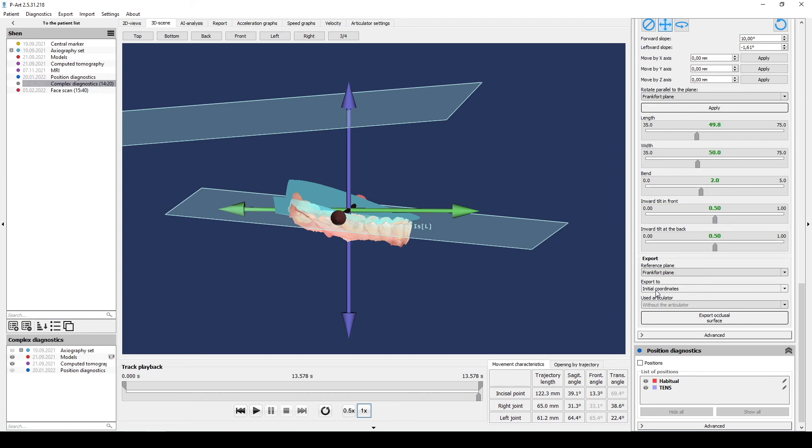All the 3D objects must be exported with same settings. For example, if you exported individual models orientated to Frankfurt plane, the occlusion surface must be exported also orientated to Frankfurt plane.